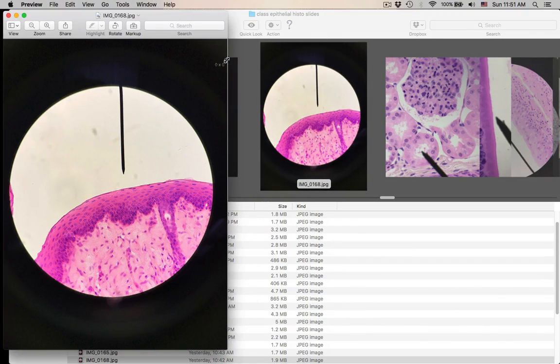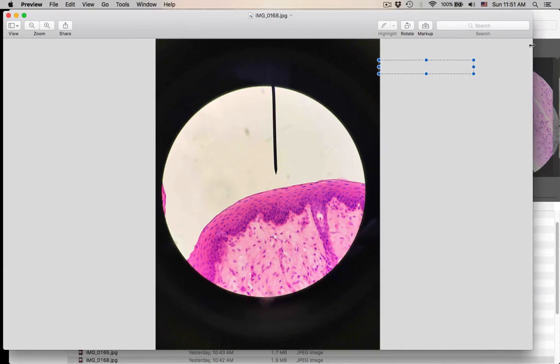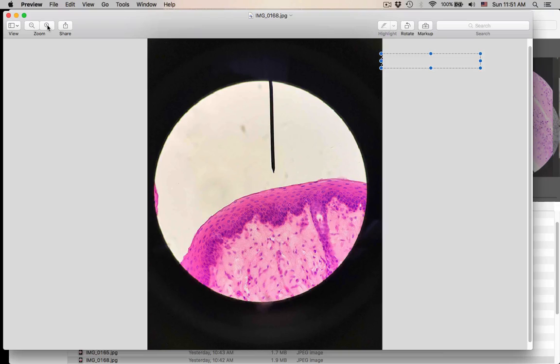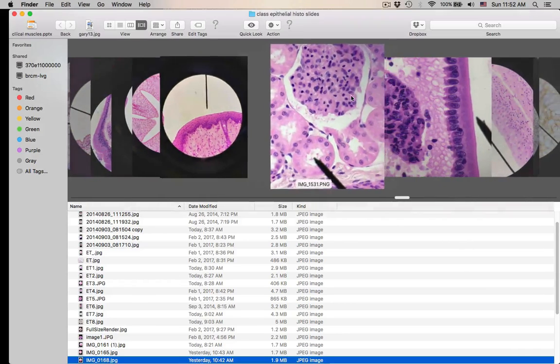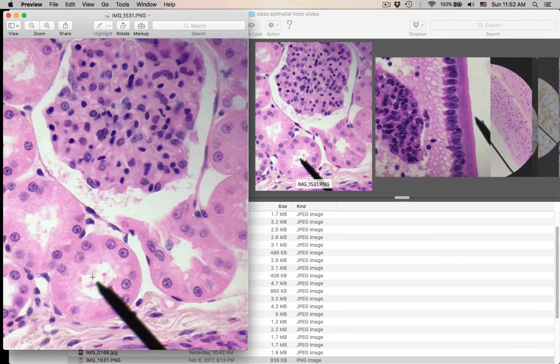21. Pointer in the lumen. What do you see? It's stratified. Top layers are smashed, look squashed. Stratified squamous. What's the next word that comes after it? Is it keratinized or non-keratinized? It's non-keratinized. This top layer is still alive. The nuclei are still there. It tells us those cells are still alive. So stratified squamous non-keratinized, that was number 21. 22. Easy wheezy. This is simple cuboidal.